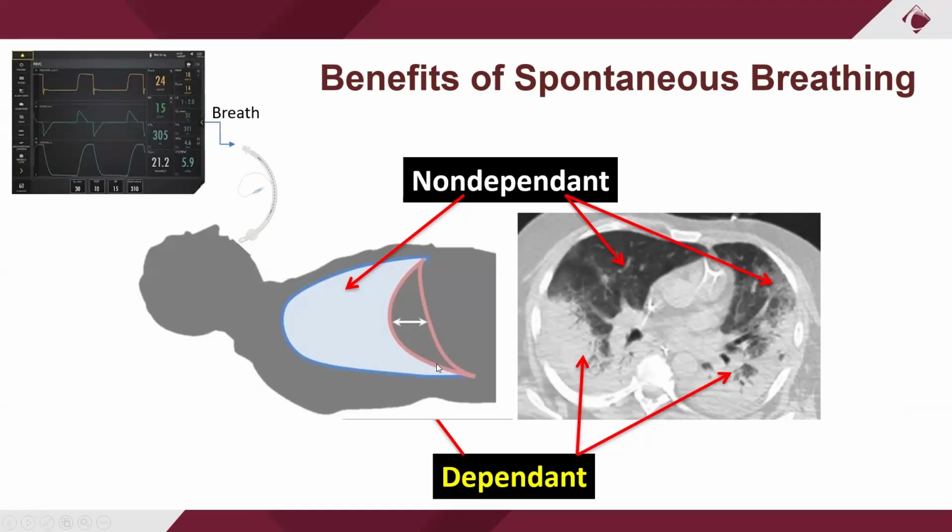chest area. And down here in the posterior dependent regions, the lower lobes behind the diaphragm are the more susceptible or high-risk areas. And this is a CT here. Again, you can see all these air bronchograms, so you know it's not consolidation, it's atelectasis, because you can see the airways are opening through here. Then you know it's a bunch of atelectasis.